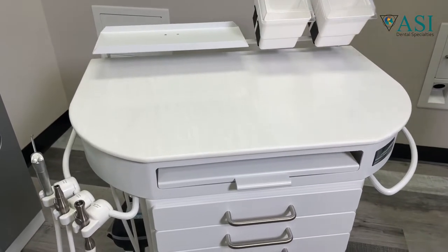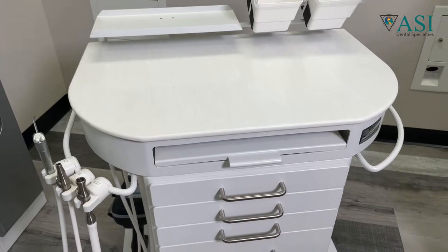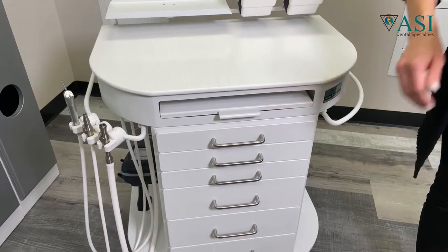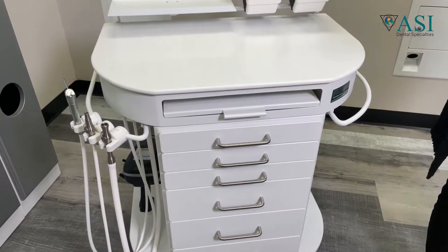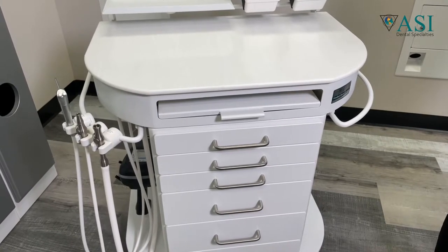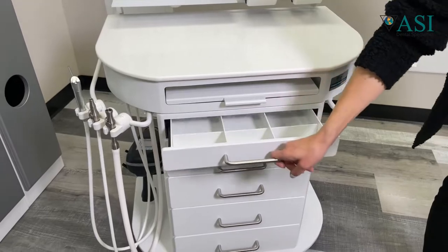You can upgrade your work top to an engineered quartz top called Cambria. The main chassis, including the front drawers, is designed with a high-grade aluminum — not particle board or a wood cabinet. It's a thick-walled aluminum with a powder coat finish. The cart includes a bank of storage drawers of various sizes, including organizer trays.